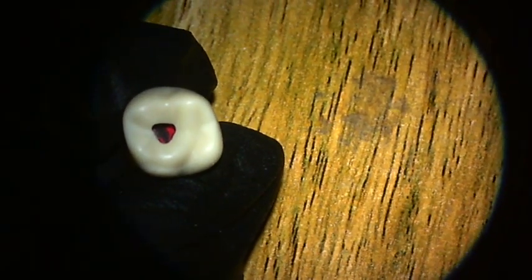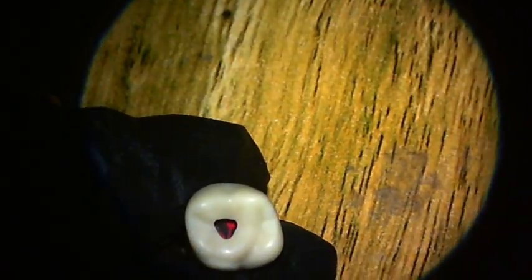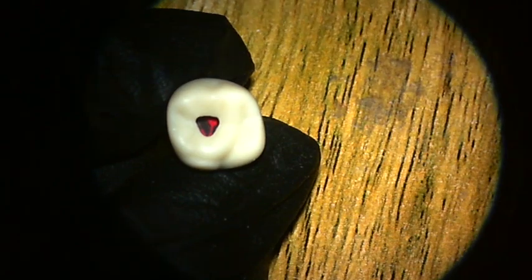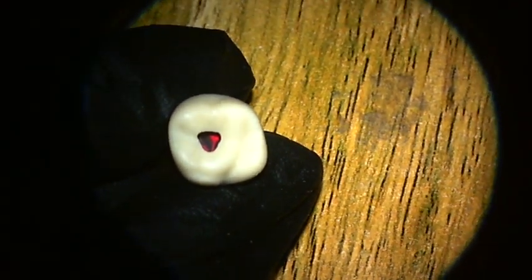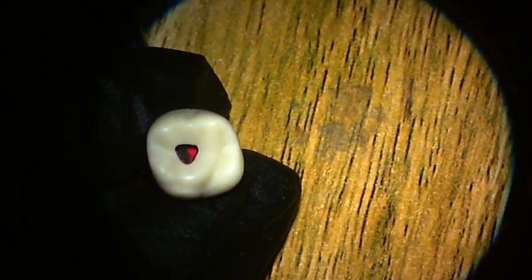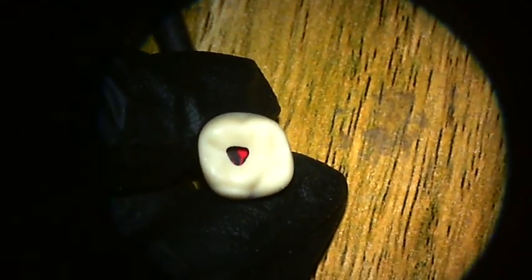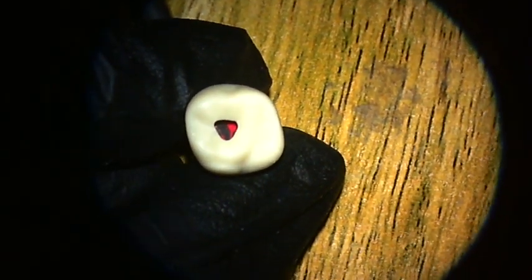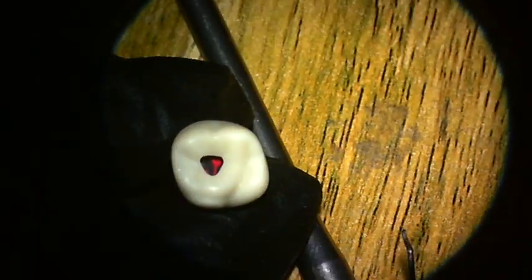Remaining pulpal horn causing minor obstruction, that's the satisfactory point. Causing minor obstruction in one orifice. Now, how do you know that you have a remaining pulp horn or not? Ideally, you shouldn't be leaving any remaining pulpal horn. However, even if you leave a minor one and it's just in one orifice, that would be all right. In more than one orifice, that's a major obstruction that will take you into the unsatisfactory level.